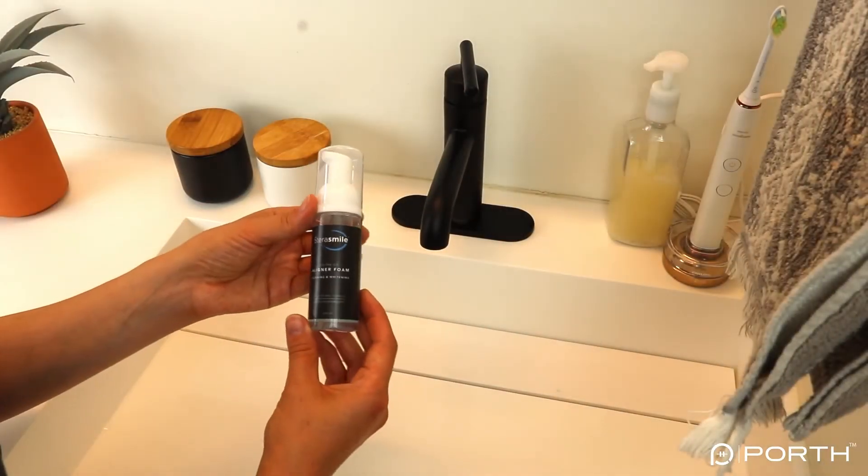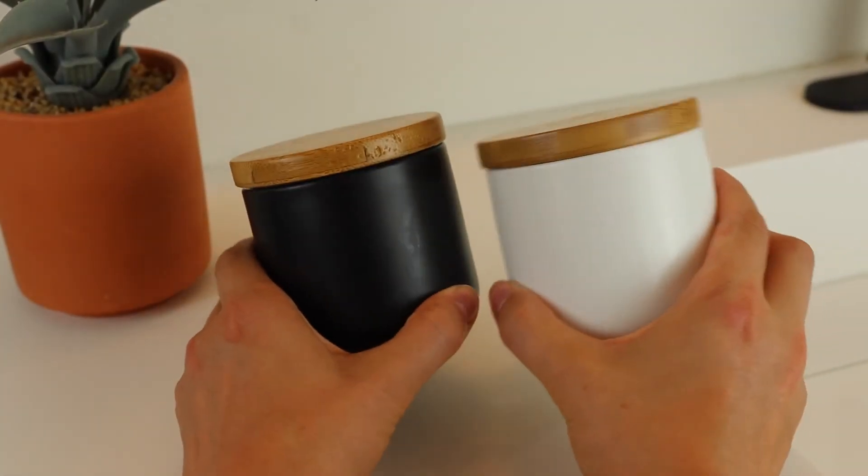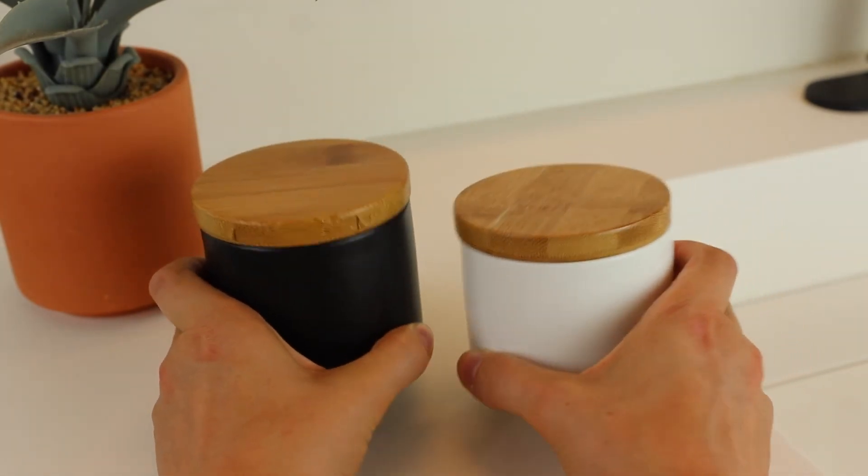Soaking your aligners isn't always an option — for instance if you're at a restaurant or at the office. In those cases you can travel with plain baking soda to lightly brush your aligners, use antibacterial soap, or Steriliner sells a little travel foam version that is small, portable, requires no soaking, and won't ruin your aligners. If you don't like the container that comes with the Steriliner solution, you can use containers I found on Amazon — in my household I use the white one and my husband uses the black, or you could use one for tablets and one to soak. I like that they are discreet and have lids to keep out bacteria. With whatever dish you choose, just be sure you're cleaning it every few days using dish soap.